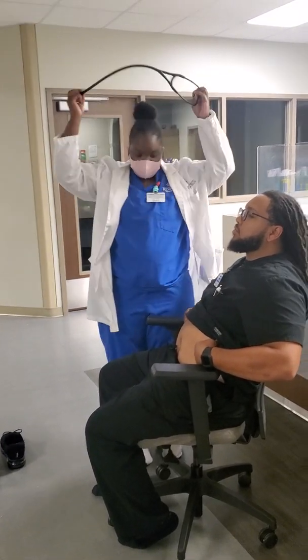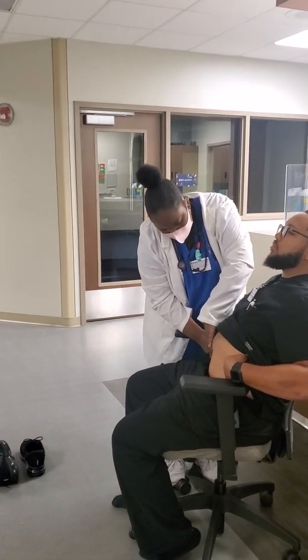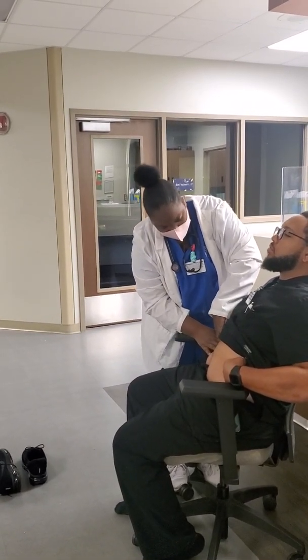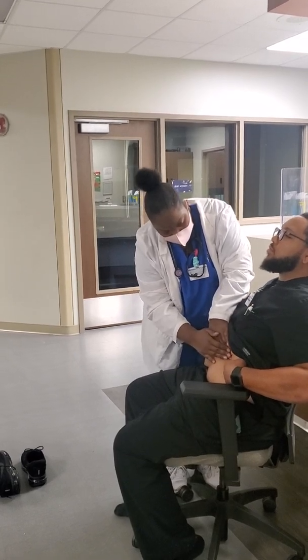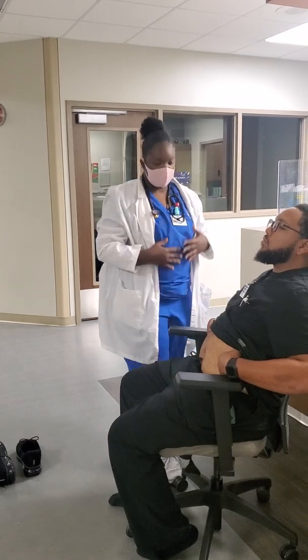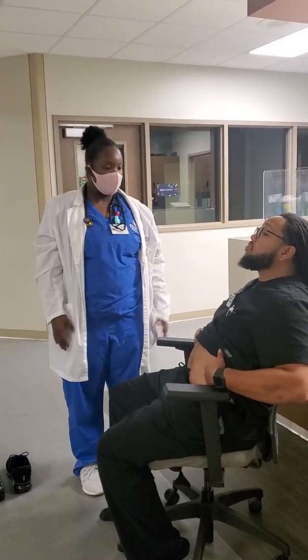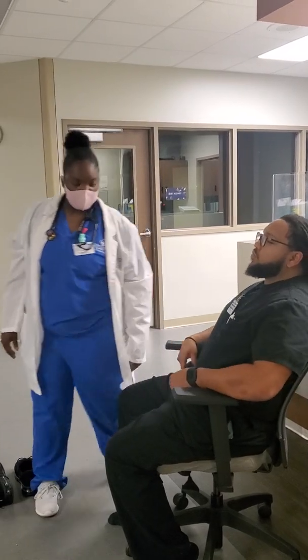Active bowel sounds in all 4 quads. I'm gonna touch now. Does it hurt when I push on it? No tenderness or distension of the bowels or his abdominal area. Okay, you can pull it down now.